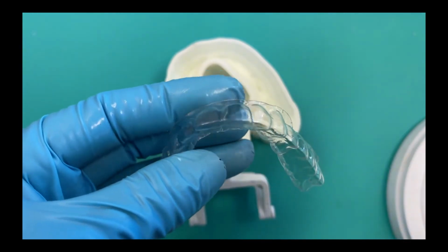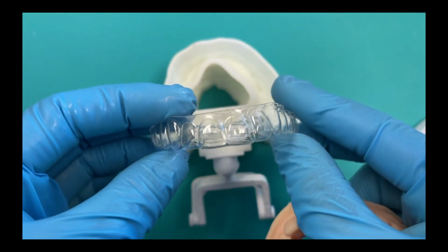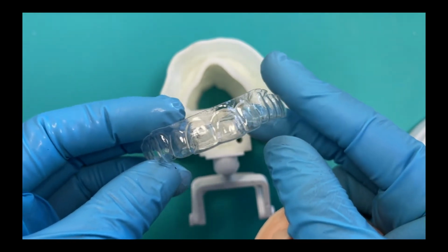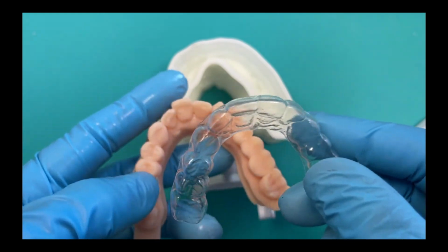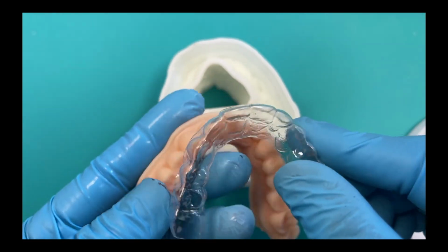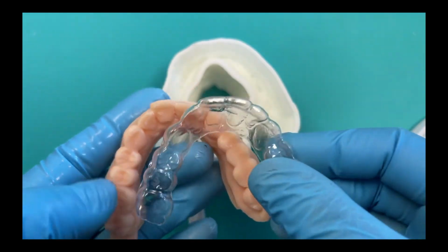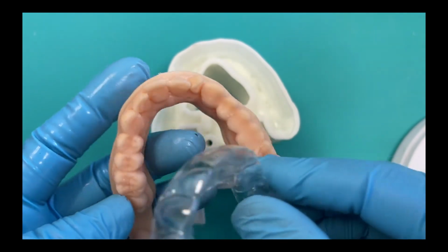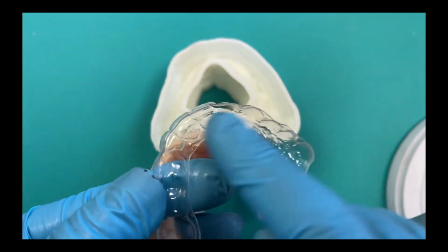And these are great because this is a nice, accurate way to be able to transfer the trial smile to the patient's mouth, let them test drive it a little bit. They get the chance to see it in the mirror. They also get the chance to go home. And in this case, it was a male patient who wanted to see if his wife would like it. Duh, of course his wife is going to like it. That works a lot better in the opposite direction when it's a woman wanting to go home and see if the husband's willing to invest in the smile.